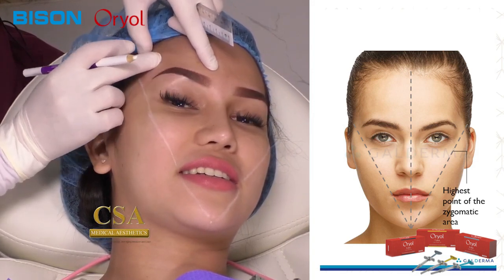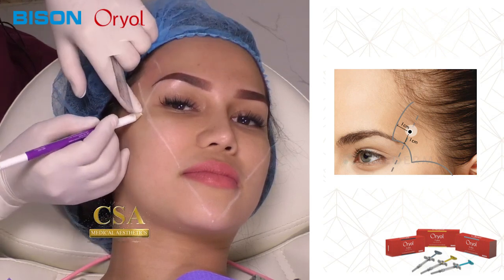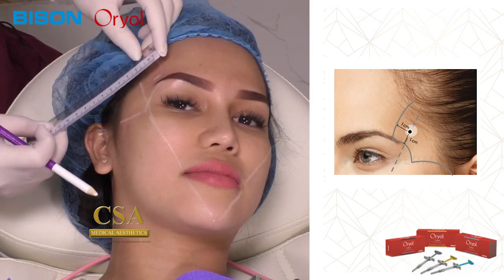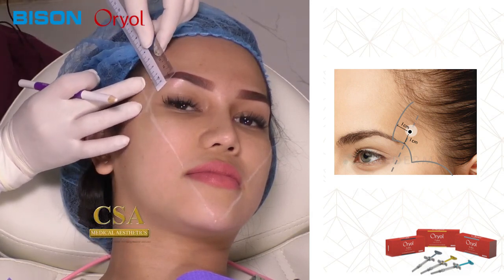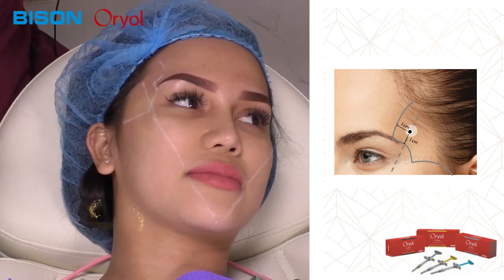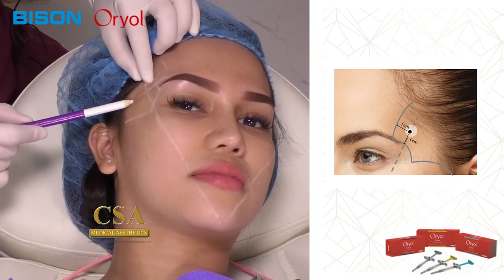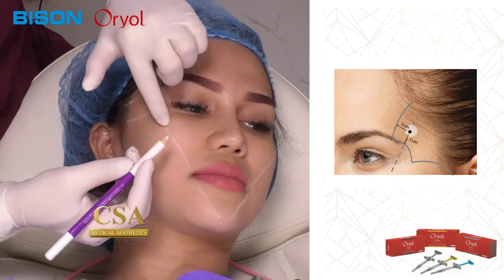Okay, so for the temple region, I still want to palpate for the temple fusion line, the lateral orbital rim, and then the superior border of the zygoma. To be safe here, I'll mark 1 cm perpendicular to the temple fusion line, so usually 1 cm or 10 millimeters to be exact if you want to make your measurements, and then perpendicular also to your lateral orbital rim. So I'm making a marking for the safe zones where I can do my injections. I also assess the highest point of the eyebrow and make a horizontal line towards my hairline, and I already have a marking of my injection points here and there.